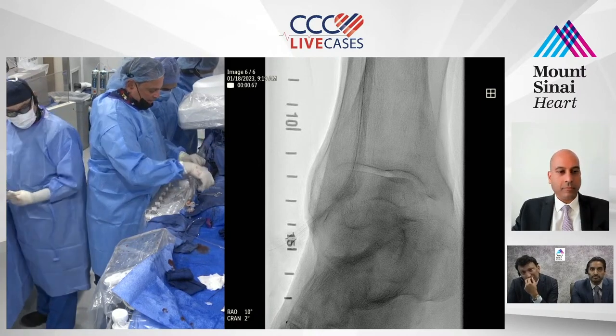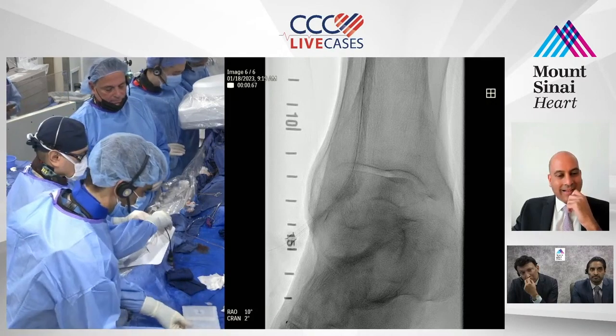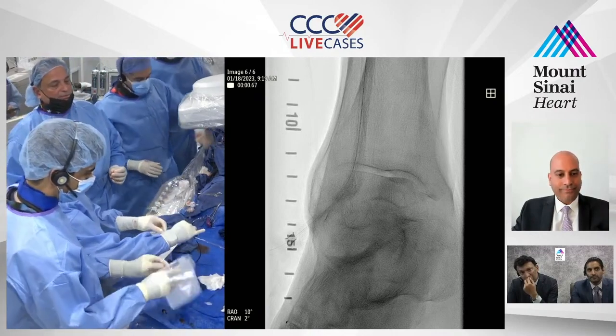Now we're going to load the shockwave on here. Now we have through and through. When you cross over, we don't care. Say again? Yeah, with the sheath. Yeah, this is a really tough case. Before that, can you give me a 5015 Viatrac?